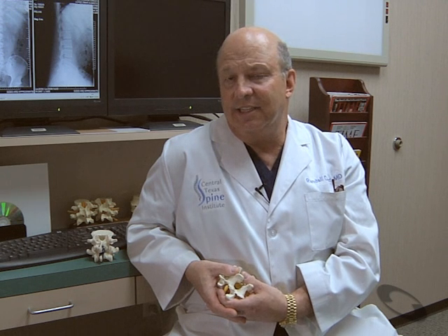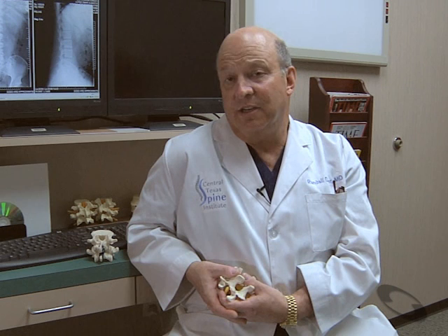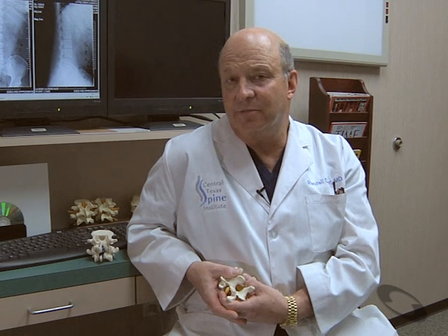I see my patients back in 7 to 10 days after the surgery. I get an initial x-ray in the office to document position of the implants. I check the wound. I see them again at 6 weeks, 3 months, 6 months, 9 months, and if they're not fused at that point, I'll see them at a year.